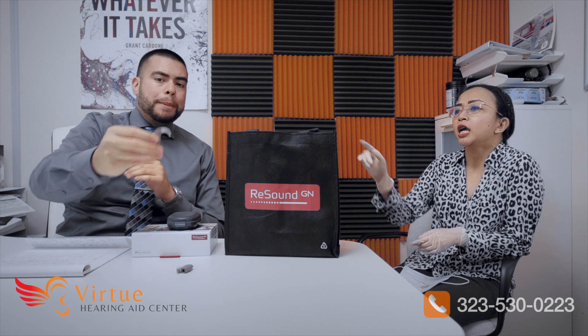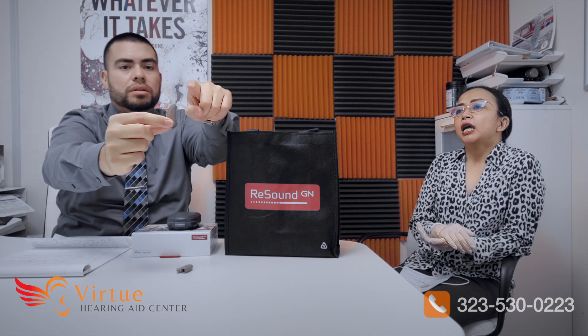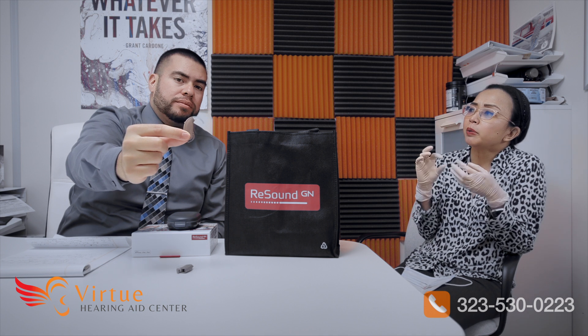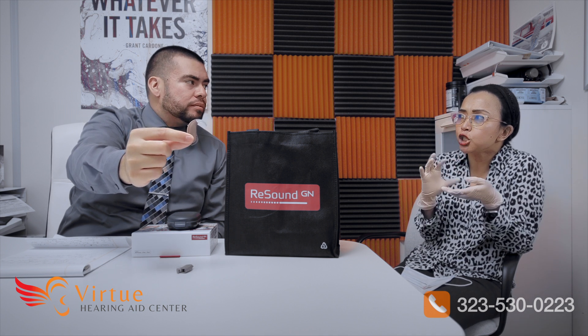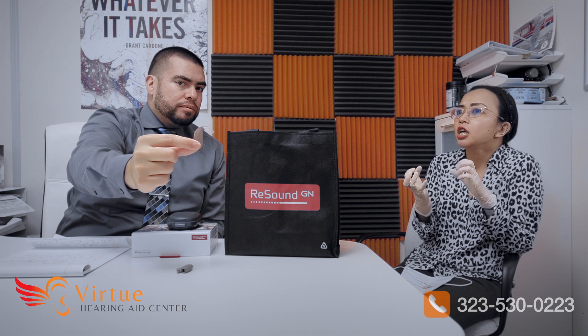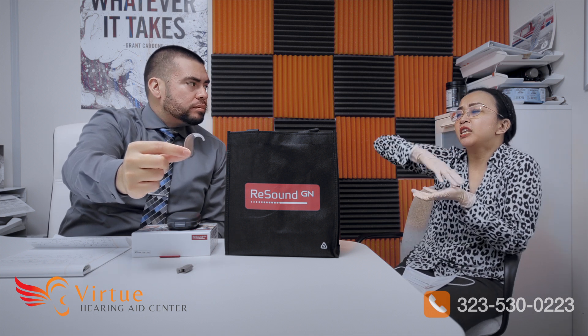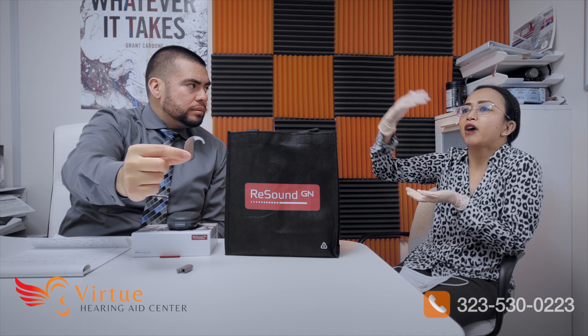That is part of our new chip, which provides that clear sound quality. But not only that — if you look at the hook itself, it's not a regular plastic hook. It's actually a mixture of hard and soft materials to provide greater fidelity for your patients, adding about 5 dB less vibration, which means less distortion.